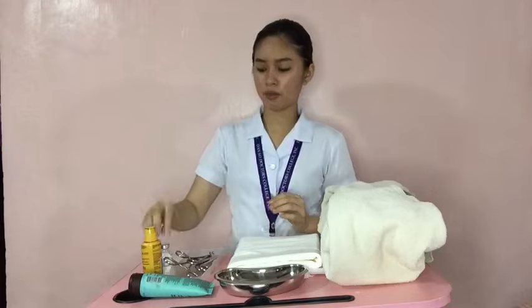Now, putting the equipment on the tray ahead of time will prevent contamination. First is the set or the tray of the catheter, which includes the sterile gloves or the clean gloves, the urinary bag and the catheter, of course the 10 cc syringe, the plaster, and we have the sterile water, the antiseptic, the lubricant, the draw sheet, and of course the forceps. This will save us time and energy.